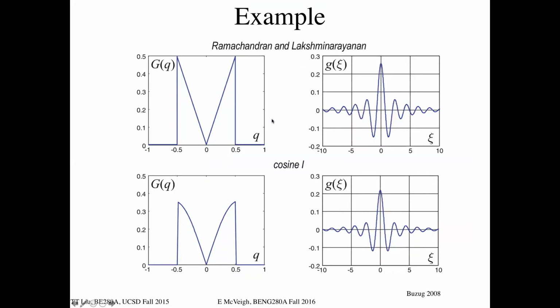But the interesting thing also is that, you know, as a filter, right? If we now just think of it as a filter that we're putting on our raw data, boosting high frequencies like this is not often done because it produces a lot of weird artifacts in terms of ringing off edges, in terms of amplification of noise at high frequencies, etc.